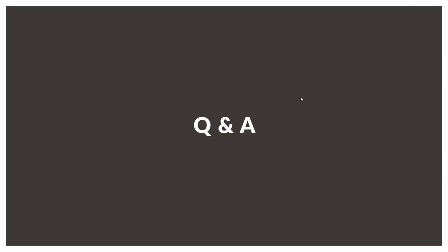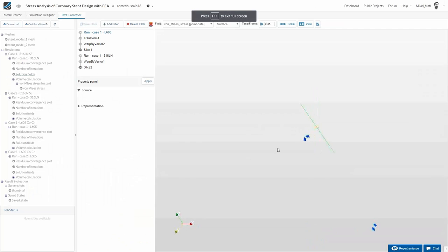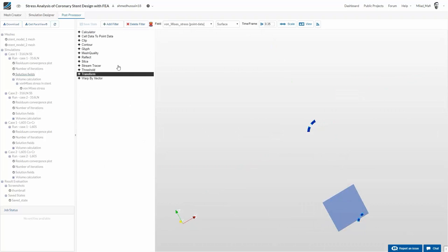Yes, that is possible. You can do it directly here, for example, but it's a little bit more complex because you first of all need to use the filter to extract, let's say, your data, for example, here, and then you can build up a pipeline to extract the data you need, and then you can compare it. But for generating 2D plots, we recommend to download ParaView for free. It's an offline version of our online post processor, and there you can easily combine several graphs.